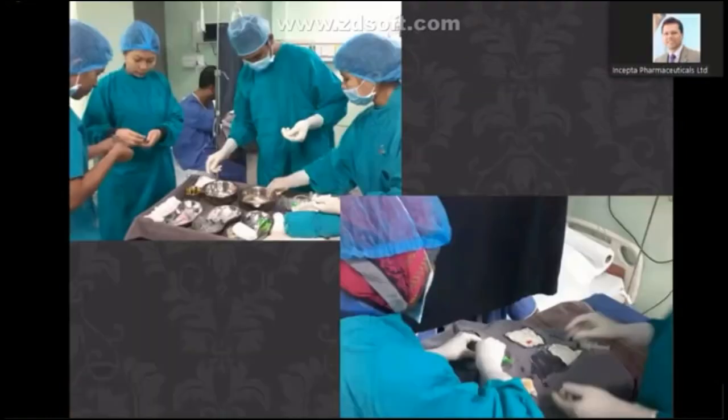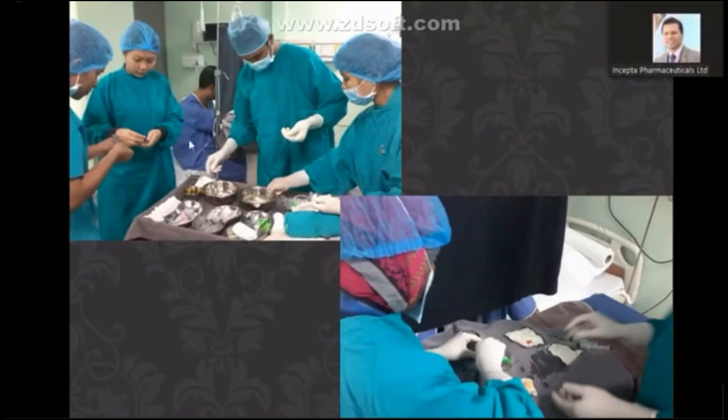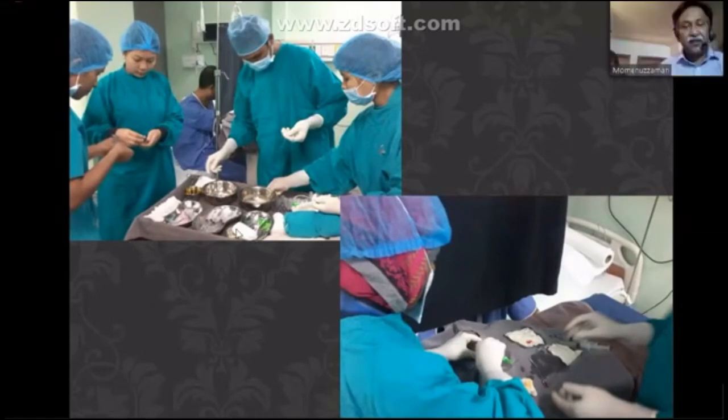And in my hospital, I make an arrangement of doing radial in a certain way. You see here, the patient is sitting on the couch. There is a black curtain. This is the trolley of sheath, 2cc syringe, cannula, and heparinized fluid. And here, my junior is puncturing the radial artery. And with this, I just do all the preparation for cannulation. All the patients here, the 8 patients, are sitting, watching the television.